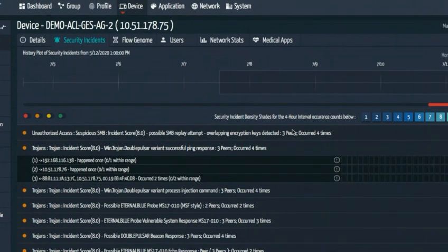And so, honestly, the different types of security activities or issues that we see on the devices can be vast. Whether we see systems that just have bad passwords that you need to change, systems that have obviously been compromised, which you might need to reinstall software on, or systems that are exhibiting known vulnerabilities or have published vulnerabilities significant enough that you want to implement compensating controls to protect them, because they're important pieces of equipment and you're highly concerned about them being impaired.